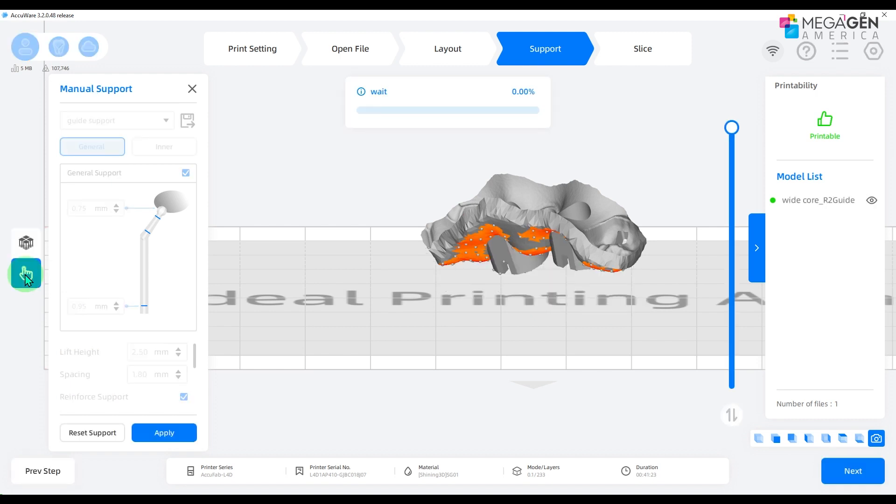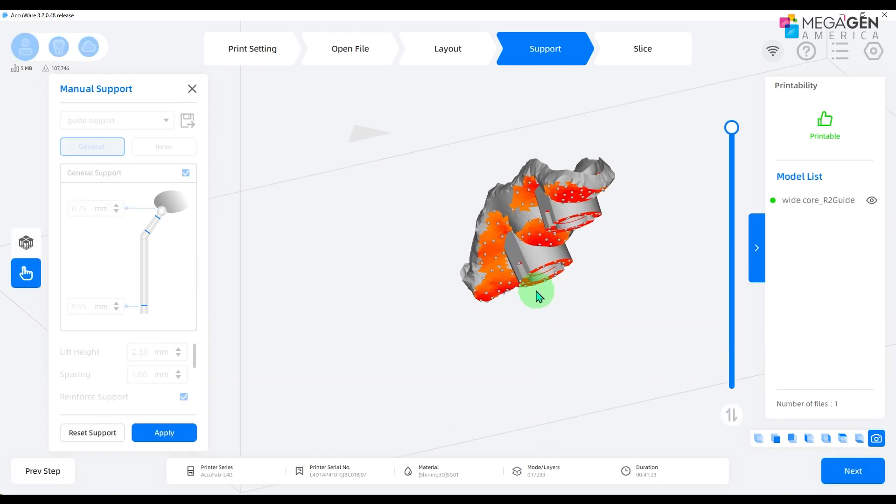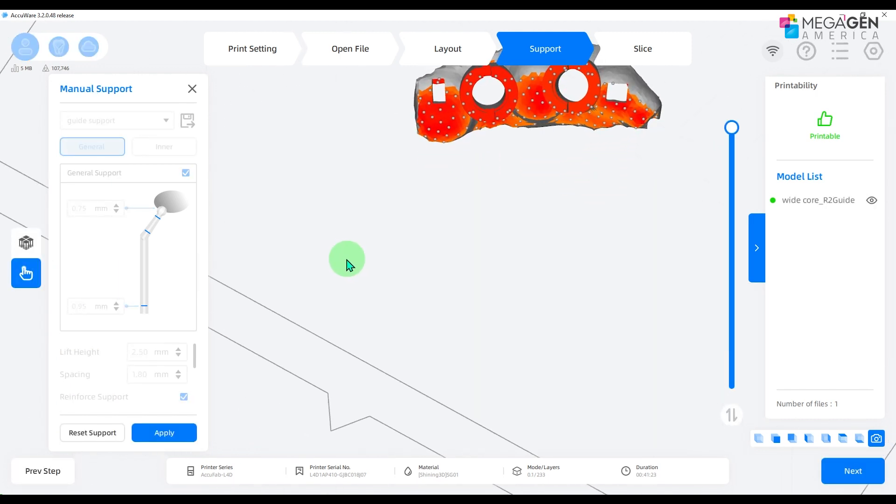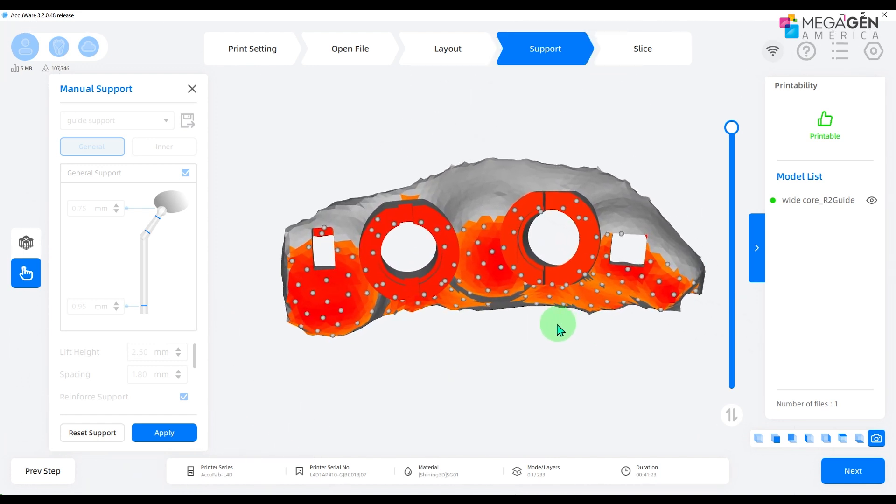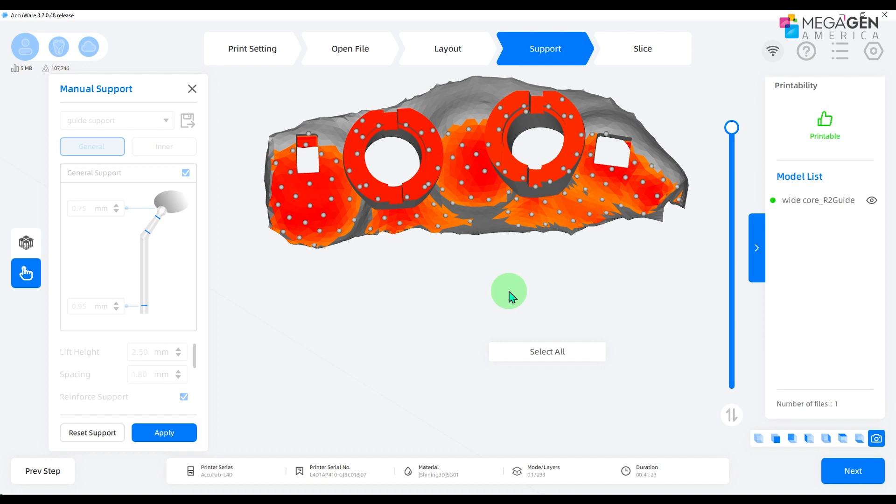For R2 surgical guides, you have to make sure the supports are not created on top of the stopper. Because R2 surgical guides are sleeveless guides, support should not be on or near the stoppers as it may compromise accuracy.